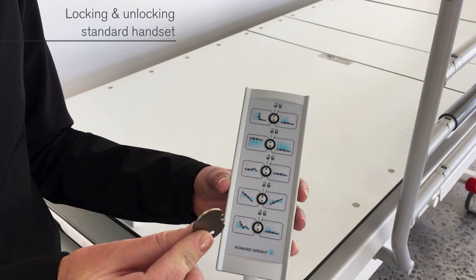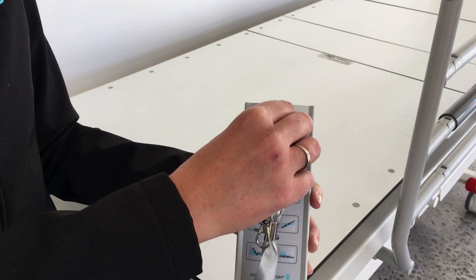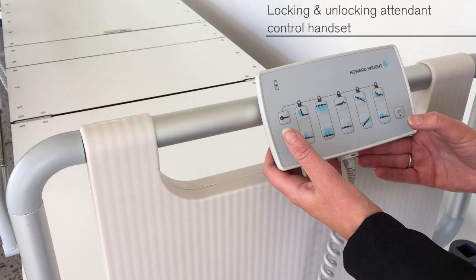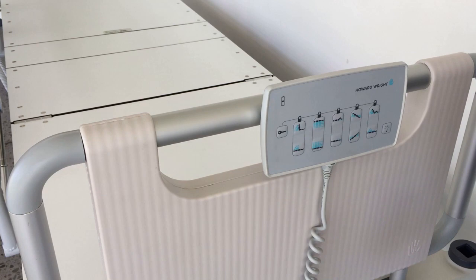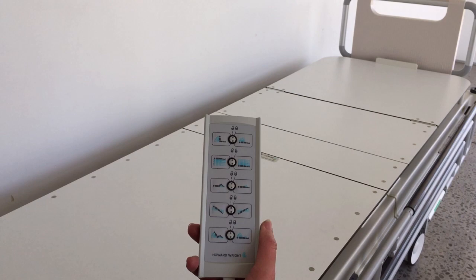The basic handset can be locked and unlocked using a small lockout key — clockwise to lock the function and anti-clockwise to unlock the function. To unlock a function on the attendant control handset, press and hold the key button and then press the function button. Unlocking a function is performed the same way. Any function locked out on the attendant control handset will also be locked out on the handset at the head end.